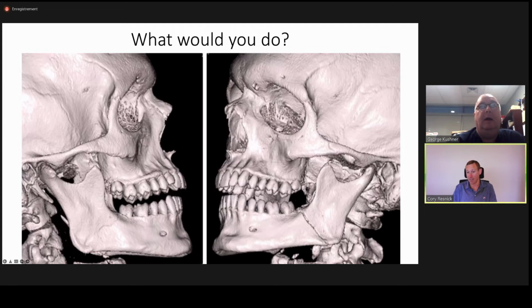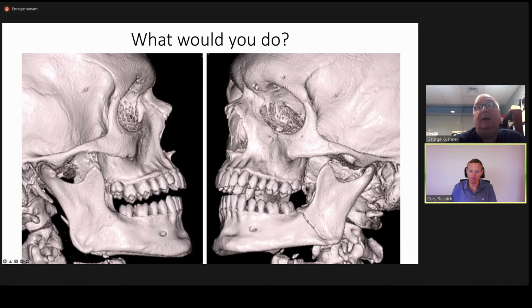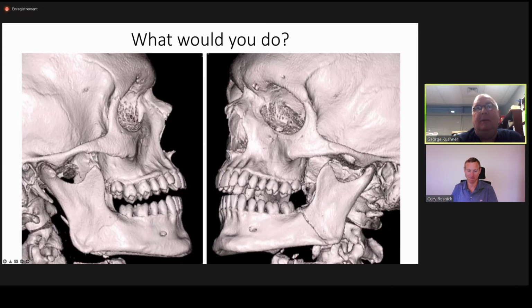I actually often do it in clinic without local anesthesia. I sometimes find that patients find the stimulation of the injection of local anesthesia to be worse than just unscrewing a few screws. It's really quite painless, honestly. Yeah, and actually I've used some Cetacaine spray or just some topical in the office. But the one thing is, you've got to have the screwdriver. So if they come to the office, you've got to make sure you have the screwdriver in your office.